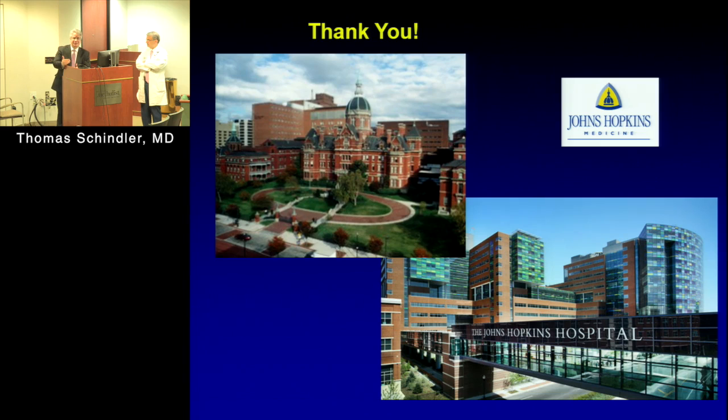And the other point is when you have transplant vasculopathy in the microcirculation with this subintimal thickening in the arteriolar vessels, you may have severe, diffuse ischemia without any obstructive coronary disease. Marcelo Di Carli showed a nice case at the ACC meeting. Beautiful, flow reserve went down strikingly, the left ventricle dilated during stress, classical TID.